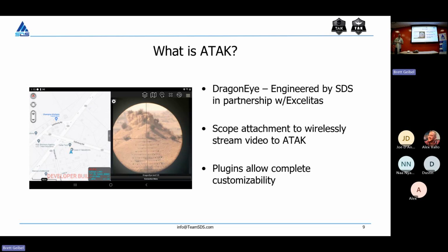One of the things we talked about, a limitation of BATDOK, is you have no control over the UI. So if you are developing a brand new sensor, which BATDOK doesn't understand how to visualize, you're at the mercy of working with the BATDOK group, which they are a great group by all means, but you're at the mercy of the time that they have, and they have their own priorities.